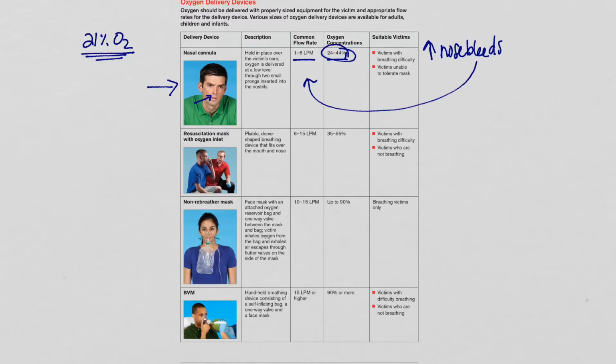Your resuscitation mask is a common tool that's used in unconscious patients most often, but it could most certainly be used in your conscious choking patients or your conscious patients as well.